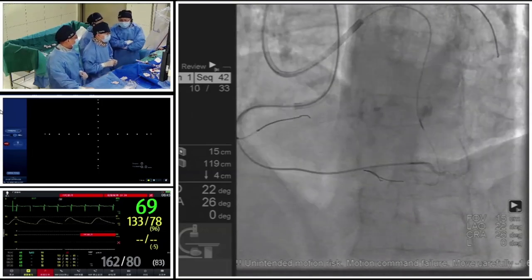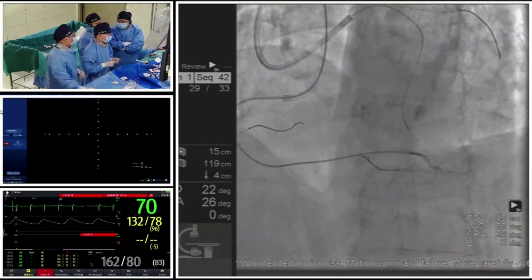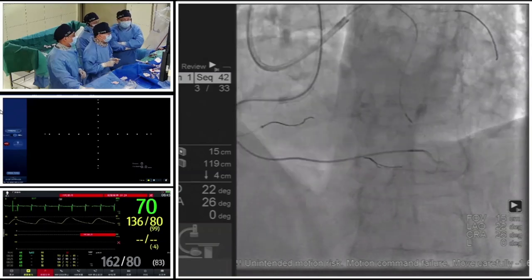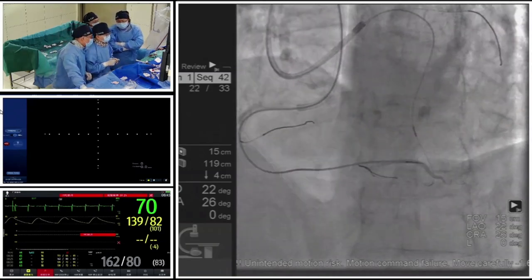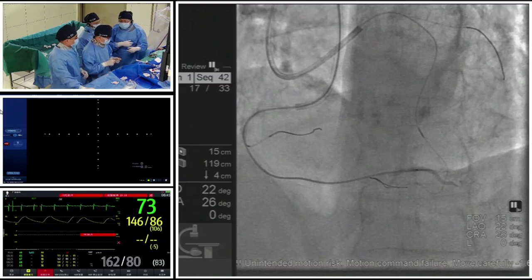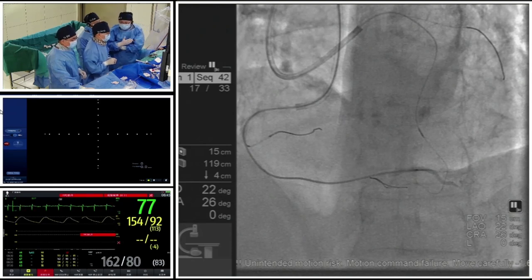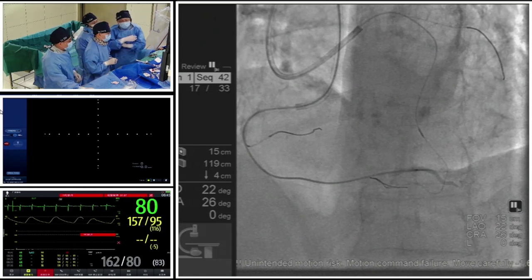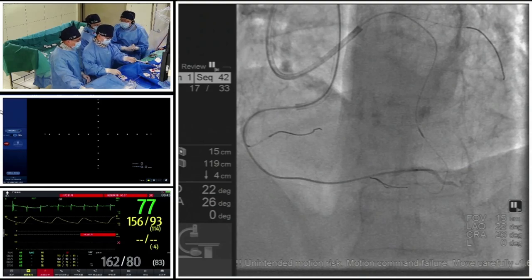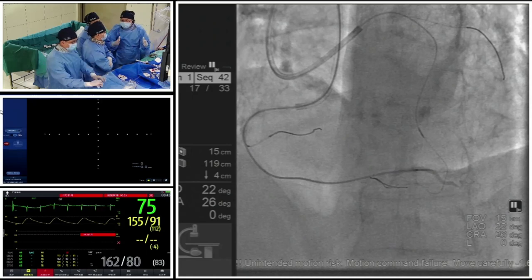So that's really the CT angiography. Intelligent visualization gives us more information. We reconsider the CTO lesion. So I suggest, especially for the first try CTO case, we should do a CT angiography and use this kind of software we made to review the distribution of the CTO lesion and the whole system. Based on the CT 3D reconstruction, we can see really stump plaque both at the proximal cap and at the distal cap. And this is a tandem occlusion case.